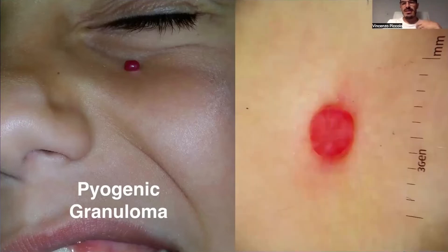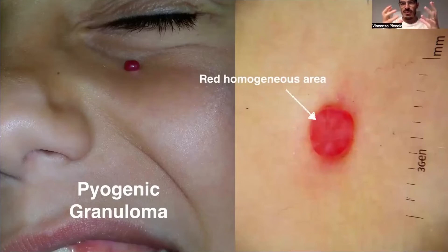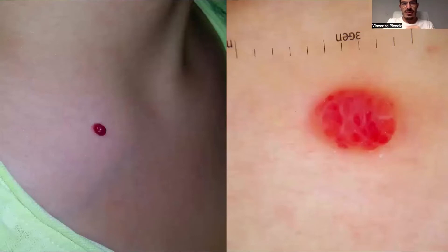In this case, at dermoscopy, what we can see is a red homogeneous area corresponding to a large lacuna — large dilated vessels at histopathological examination.